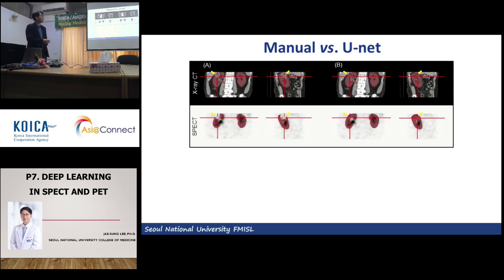Yeah, but in a few cases we could also find some error in the deep learning outcome. I mean the human drew well and excluded this part, the tumor or the cyst, but the deep learning network couldn't distinguish this area from the rest of the kidney parenchyma.